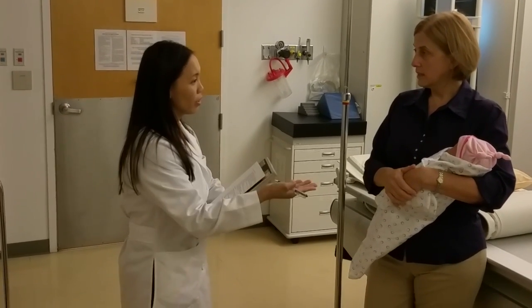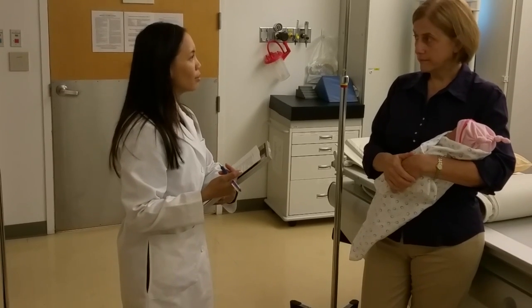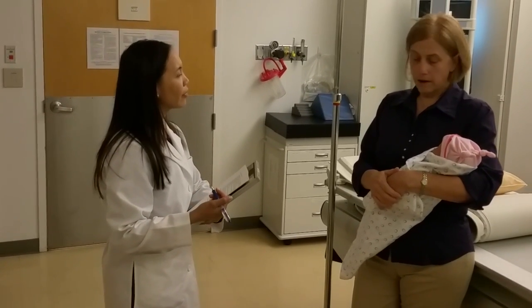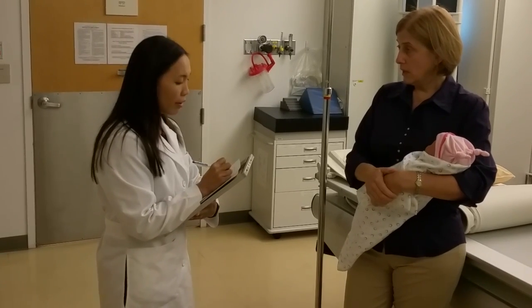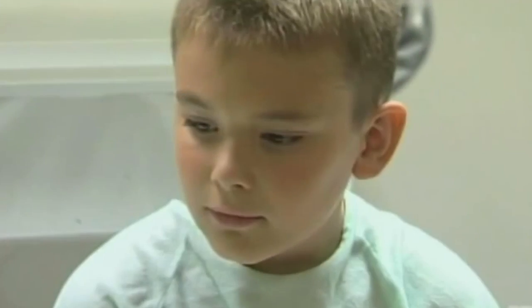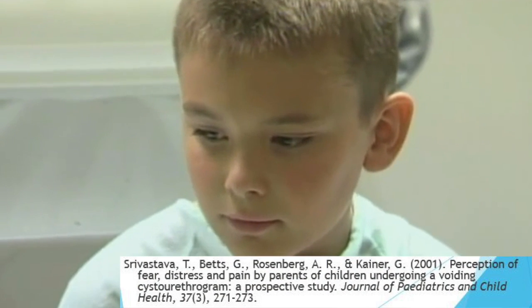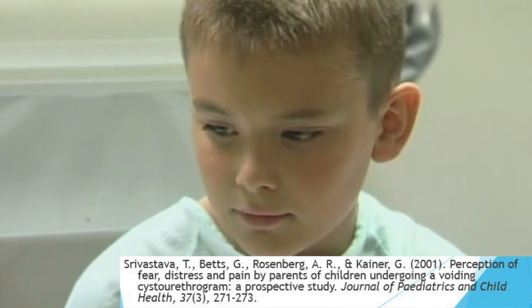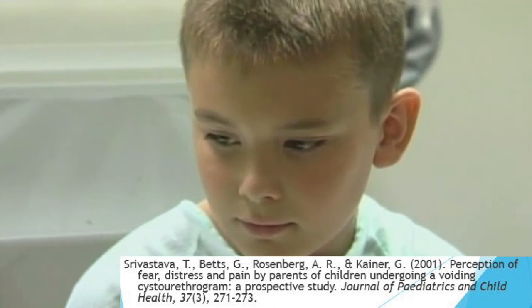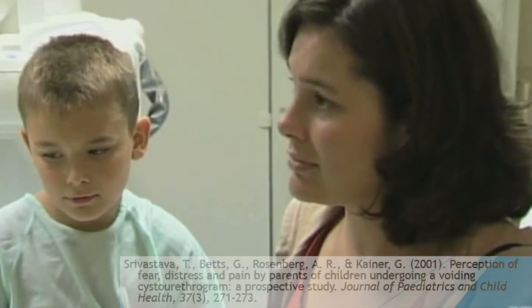Even though VCUGs are one of the most commonly performed fluoroscopic investigations in pediatric radiology, they are also uncomfortable exams that can cause high levels of anxiety and stress. Since studies have shown that a child's distress and anxiety is increased when the parent is anxious or upset, but also reduced when the accompanying parent is calm, you should make a solid effort to explain the procedure to the parent to reduce their anxiety and therefore the child's distress.